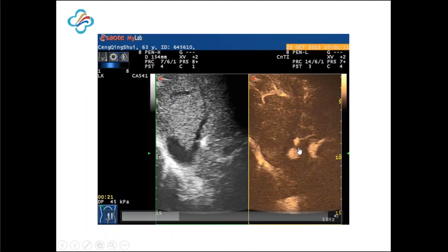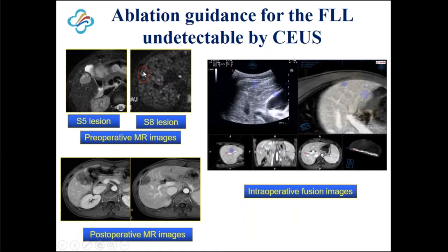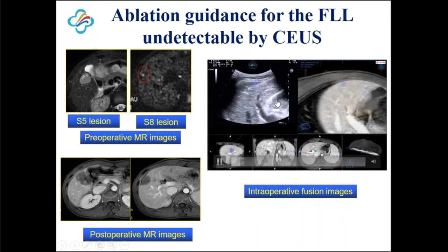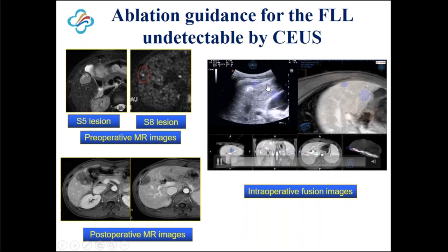For another case, there are two lesions: one in segment five and a tiny one in segment eight. For the segment eight lesion, we cannot see it on contrast-enhanced ultrasound. So we use image fusion to locate the lesion, insert the electrode, and do the ablation. After the ablation, we can see the lesion has been ablated completely.